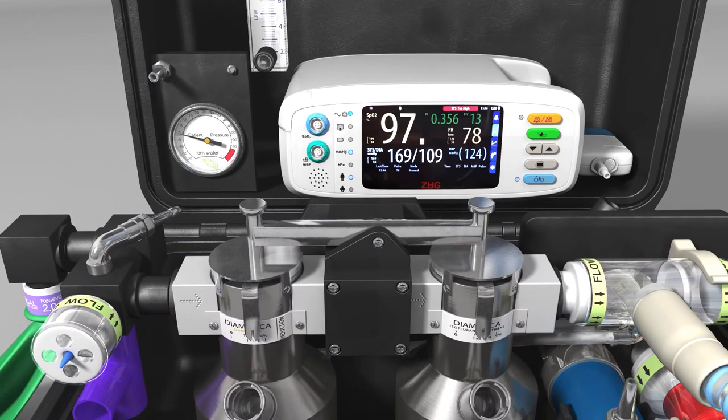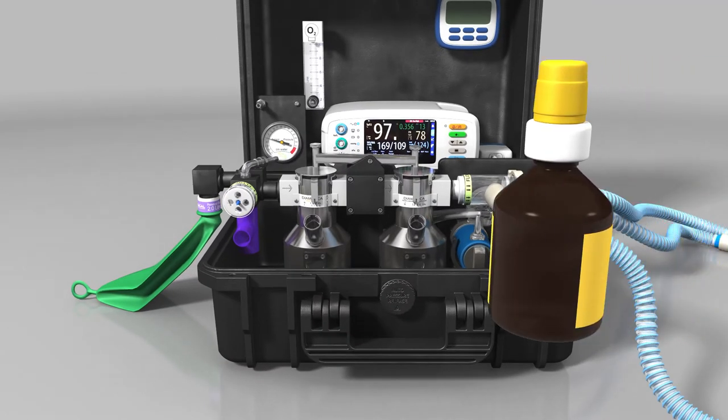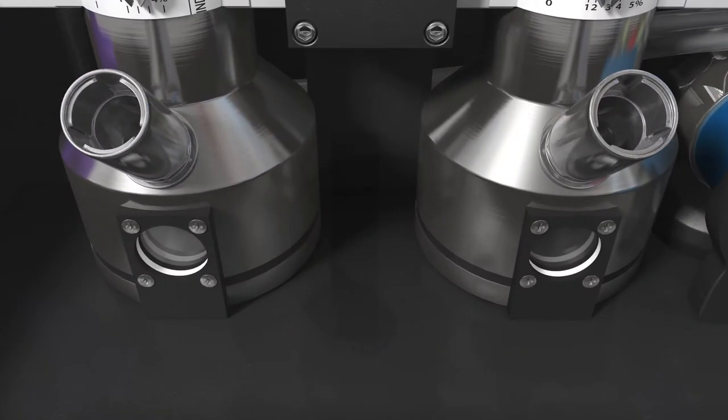The DPA Duo has two vaporisers fitted with a pivot interlock system allowing seamless and controlled changeover between both vaporisers, with no possibility of having both units in the circuit simultaneously. The vaporisers are designed to be used with specific anaesthetic agents and are equipped with filling systems to enforce the same. The vaporisers can hold up to 150 millilitres of anaesthetic agent and the level of agent should always be visible in the sight glass.